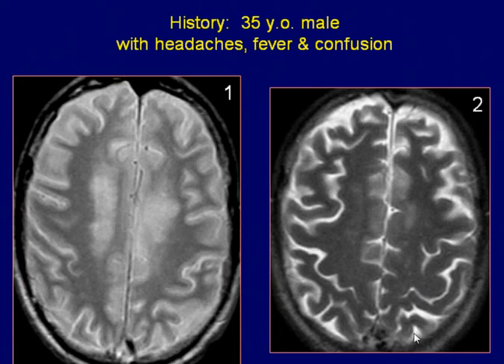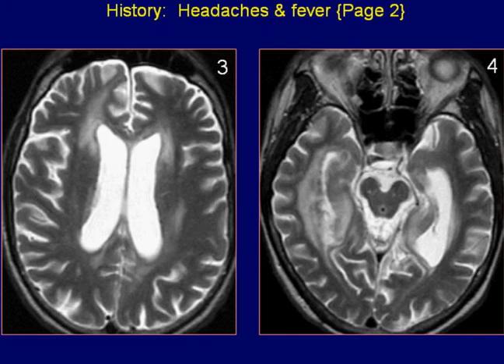35-year-old male with headaches, fever, and confusion. Axial proton density and T2-weighted images of the brain reveal diffuse bilateral hyperintense white matter lesions. Axial T2-weighted images at a more caudal level demonstrate again diffuse white matter lesions on both sides of the brain.